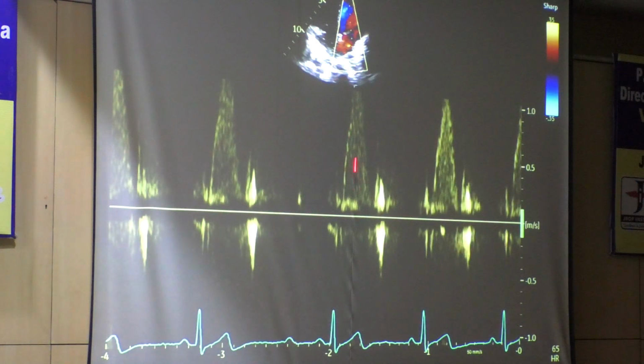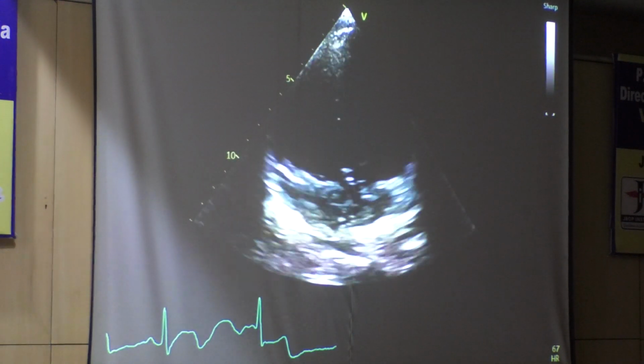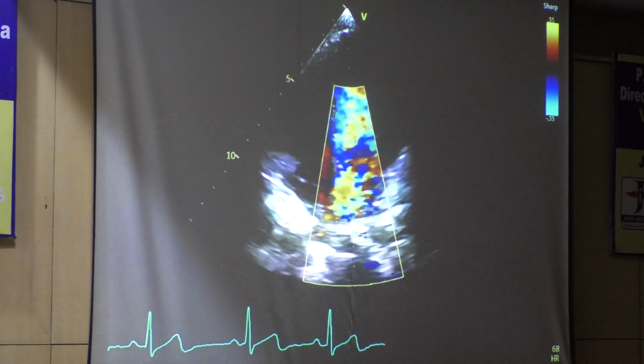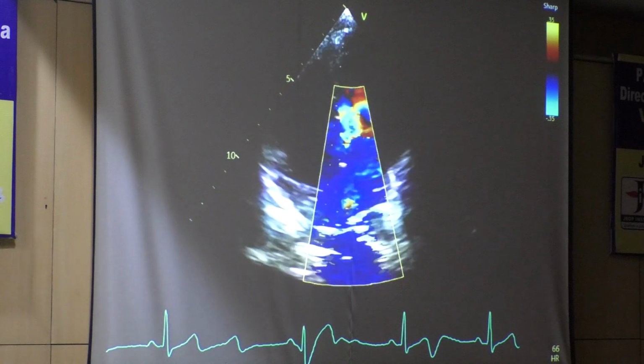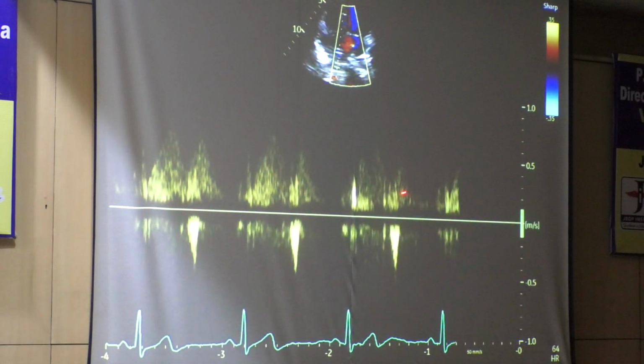It's picking up the aorta. It works in a slightly bigger child; a smaller child will be weak and will not let a demonstration be done. They will not allow anything. Now you can see the pulmonic veins very clearly.